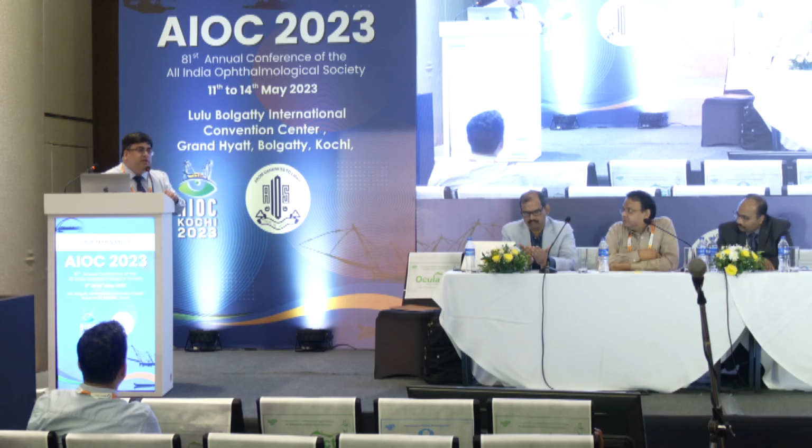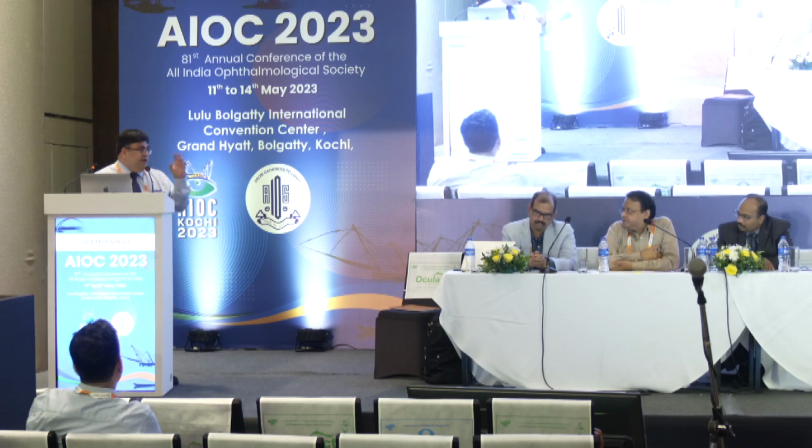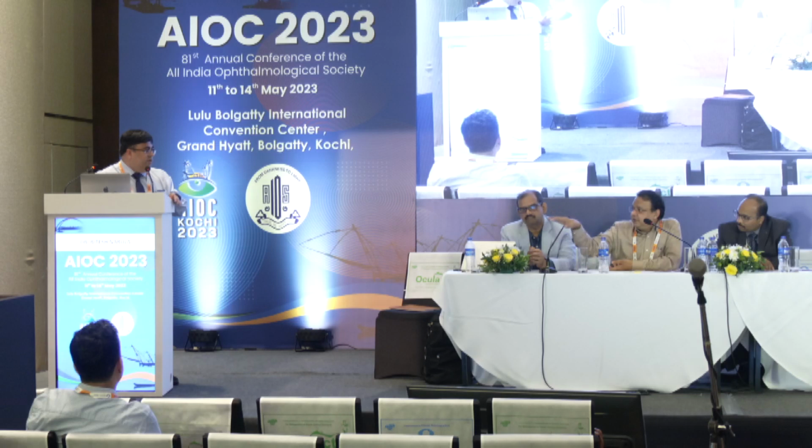But if you're looking at something which can act for you both as a camera plus an OCT angio, or something which acts as an angio plus. And I want a definitive answer. You are giving no, no, pros and telling us cons. It depends on what you need in your practice. You have to decide if you want to buy two separate machines, a camera separate from an OCT angio, your choice. If you're looking at a standalone OCTA, what machine would you buy?